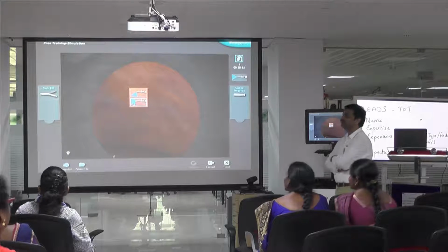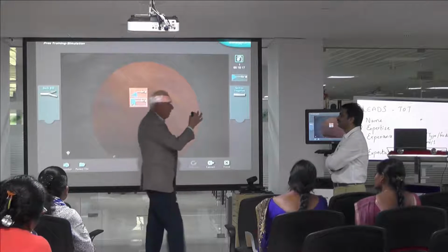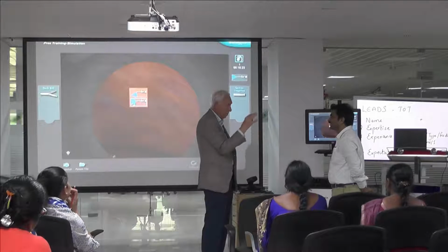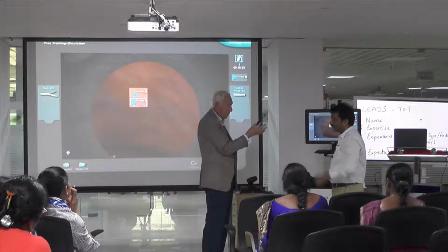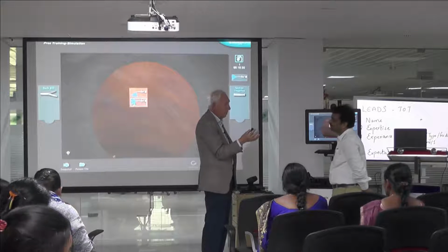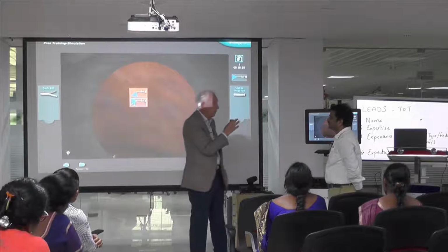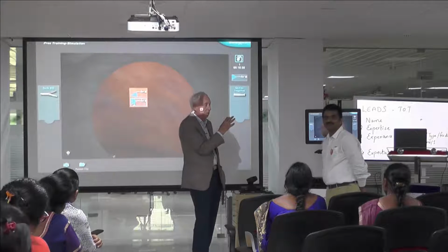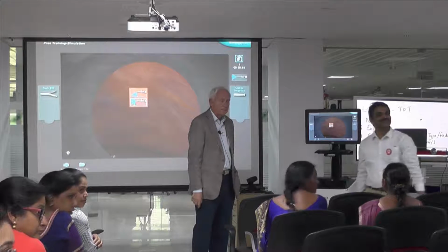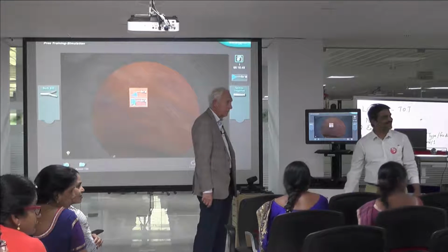Now, you know exactly how I like to see that the end product looks. No dissection further on, only dissect as much as you need. Avoid getting too centrally close to the common bile duct. The machine will show you that the dissection was not 100%. Because if you would go for 100% dissection, you could cause trouble.